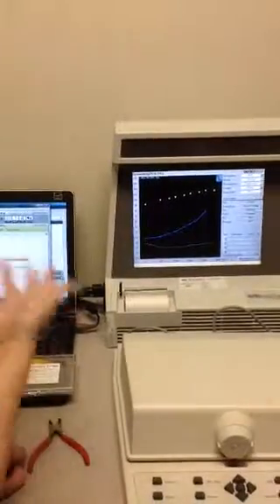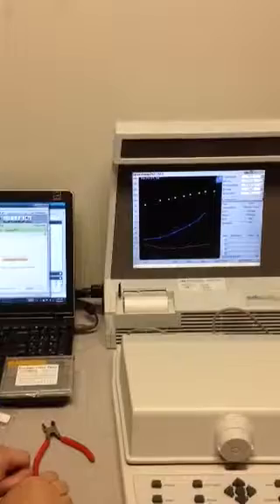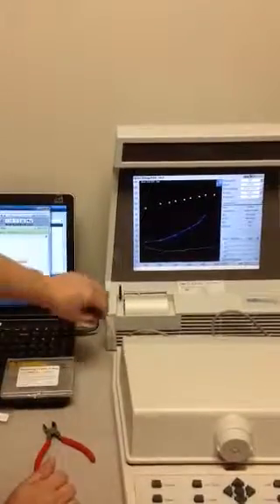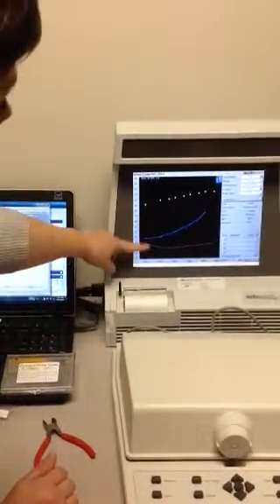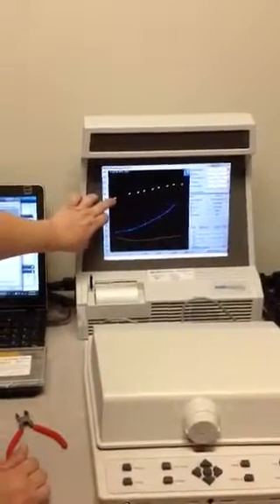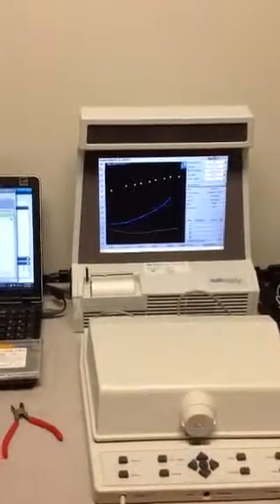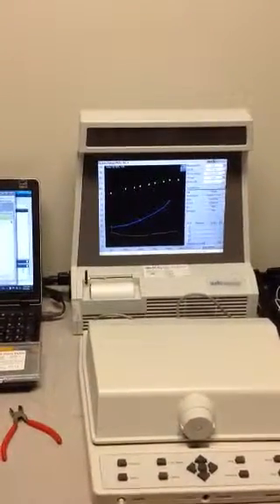Alright, so it doesn't matter if we measured her LDLs because NAL's not really going to use that for the calculations. It doesn't really matter to them. So when we look at this, our floor is her thresholds and our ceiling are the LDLs. These are average predicted based on her thresholds. So I'm going to go in, I'm going to unmute my hearing aid.